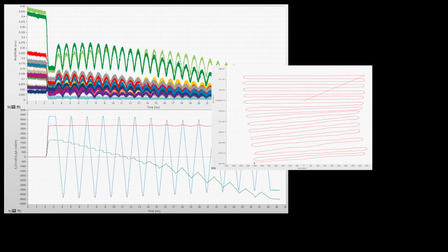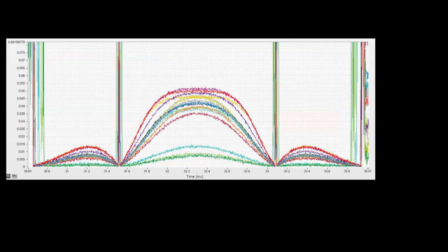So thanks to Cameron's help and also systematic troubleshooting with Gabrielle, we figured out that there was actually leakage of transmit signal coming from the scanner itself and basically tipping the field probes inadvertently. Cameron was very astute and observed that the 180-degree pulse within the sequence was not fully zeroed out when we were doing the field camera acquisitions.